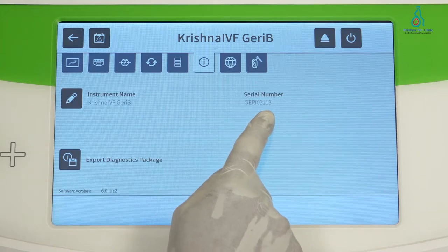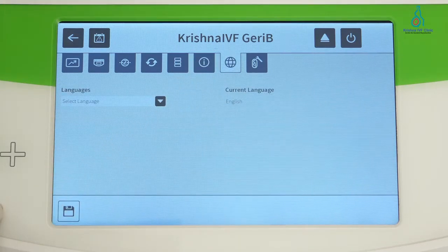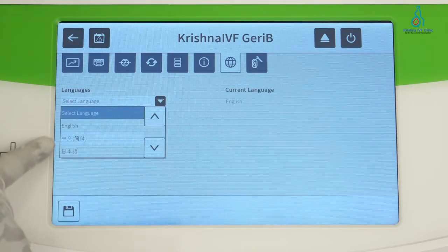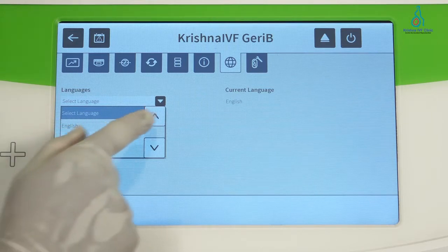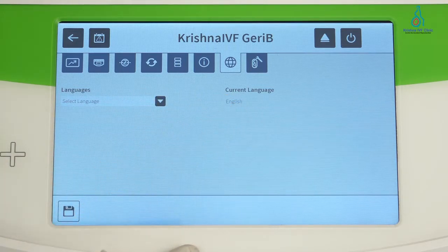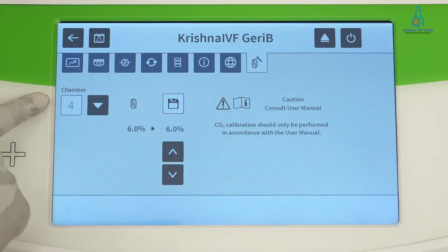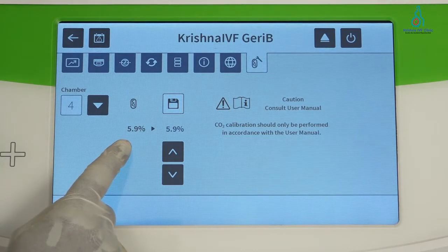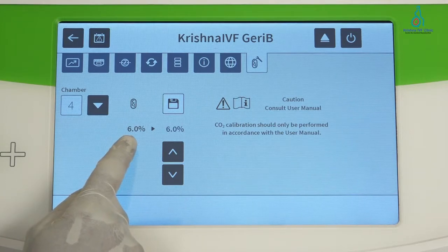This is the serial number of the instrument. This screen shows the language settings — here we can select the language as needed. On the CO2 adjustment screen, we select the chamber and it shows the current CO2 level for that chamber. This screen can also be used for calibration purposes.